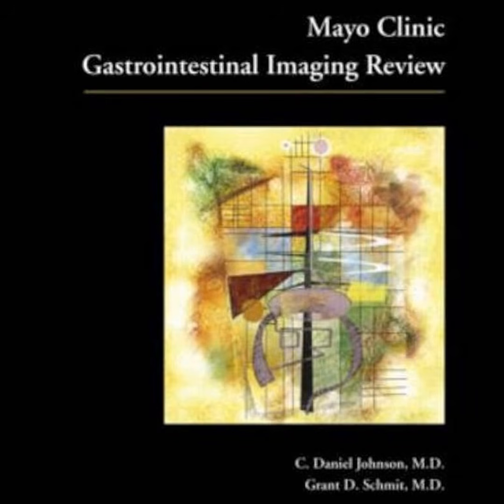Exactly. But if a severe inflammatory process can do the exact same thing mechanically, how do you differentiate an infiltrative cancer from, say, a granulomatous disease on a scan? Yeah, how do you, if the stomach looks the same? Well, often you actually cannot rely on the gastric imaging alone. You have to look for the systemic fingerprints of those mimickers.